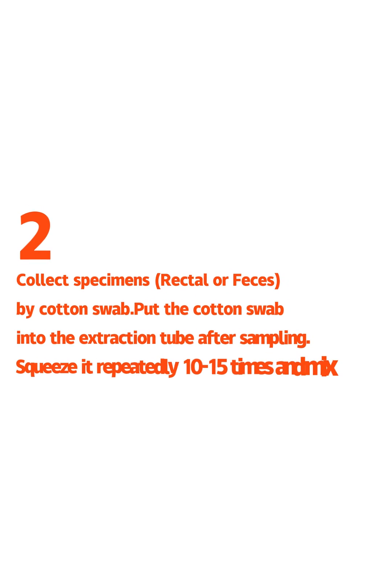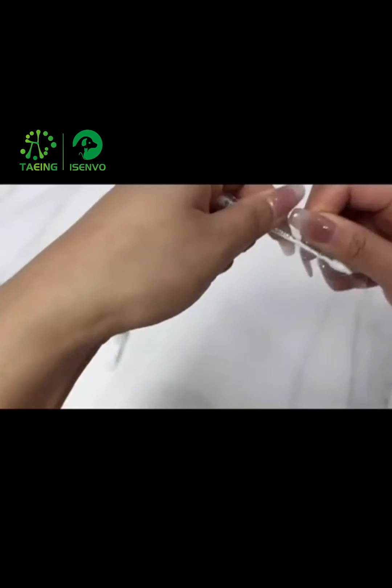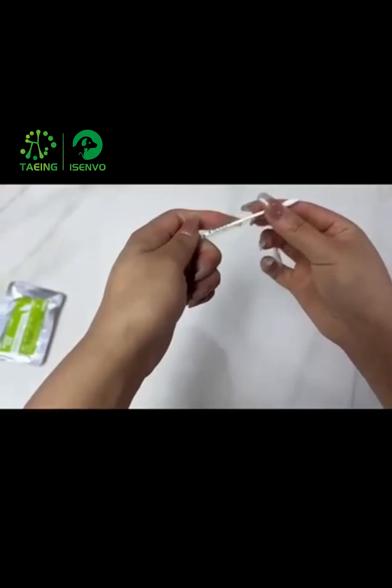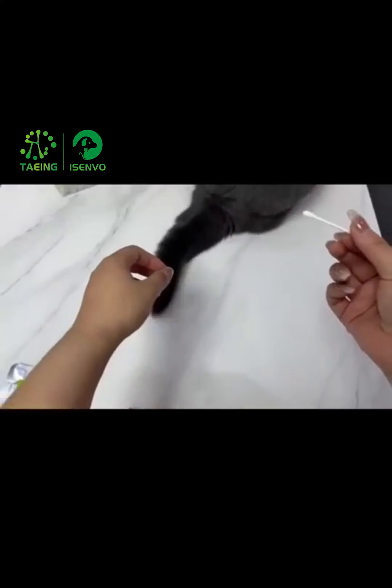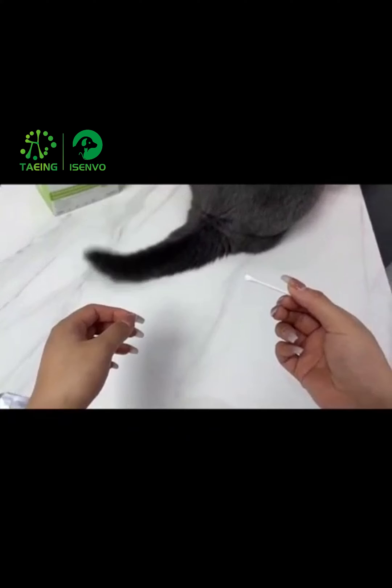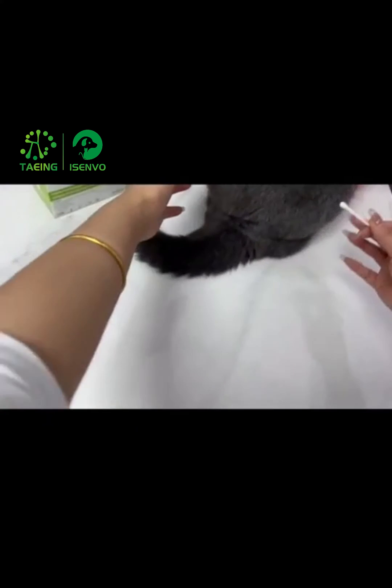Step 2. Collect specimens: rectal or feces. By cotton swab, put the cotton swab into the extraction tube after sampling. Squeeze it repeatedly 10 to 15 times and mix well.